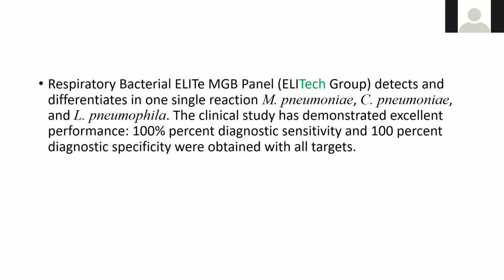Here's one: a respiratory panel of the Elite MGB panel detects and differentiates, in one single reaction, Mycoplasma pneumoniae, C. pneumoniae, and L. pneumophila. Oh gosh, it's a good test, isn't it? Good test question right here for y'all today. Did I help you with the Mycoplasma pneumoniae? What's the C. pneumoniae and what's the L. pneumophila?